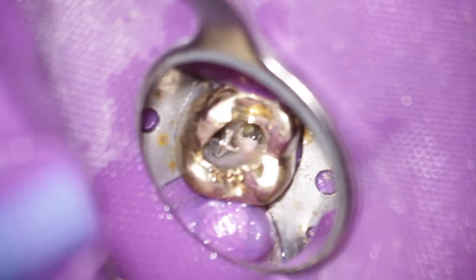A very thin needle-like diamond burr was very helpful to remove the resin out of the spaces in between the cross spaces of the post, as you can see here. You might be able to imagine how difficult it was to remove it, because the patient had a very limited mouth opening.